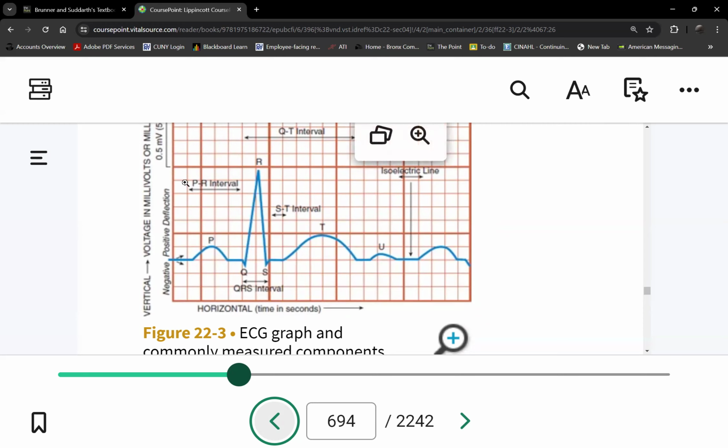Of course the U wave is present only in, let's say you have a low potassium. Usually, that's the cause of a U wave. And a few other things, but again, the U wave is not always there, so it's not really that significant. Plus, we have other ways to find out if the patient has a potassium abnormality anyway.